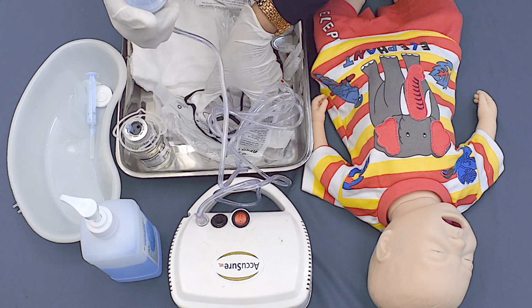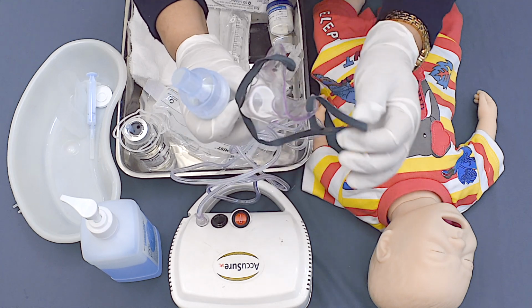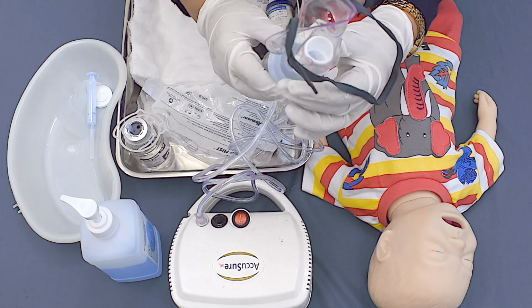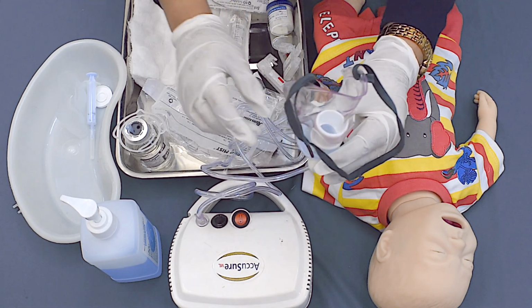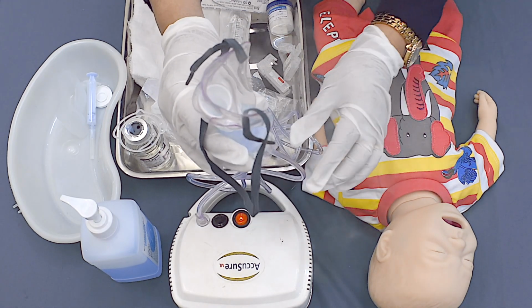This kit has to be connected with the face mask. Do not touch the inside of the mask. Once the mask is connected to the kit, turn on the nebulization machine. Let the fumes come.